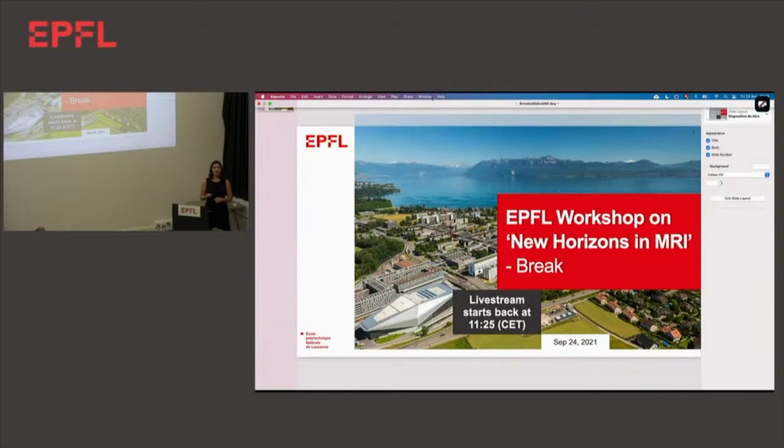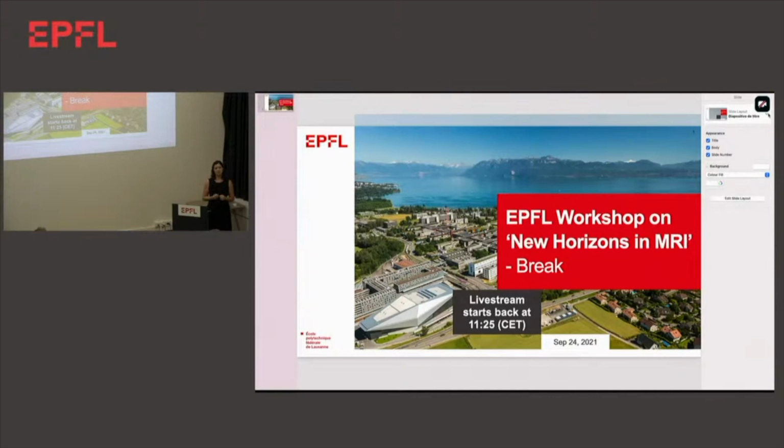I think this actually in the heart hasn't really been a problem. We do see this in the prostate, where with conventional imaging approaches, we've seen the T2 can get to 200 milliseconds or so, but when we do fingerprinting, we're getting larger values that we didn't expect to be seeing, and we didn't design our pulse sequence to be able to capture really accurate differences at higher than 200 milliseconds. So that's going to cause some problems.